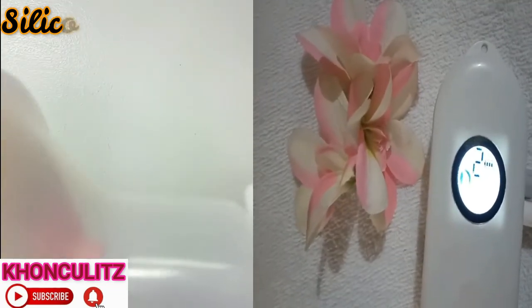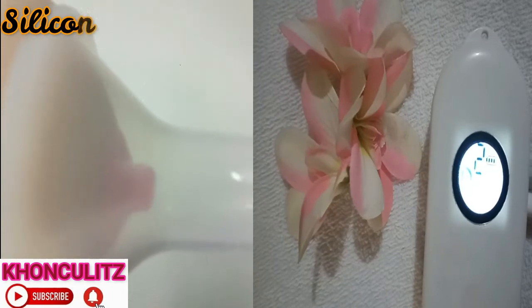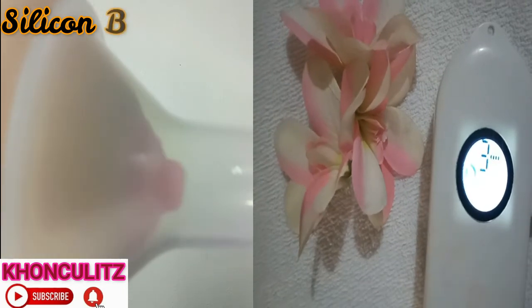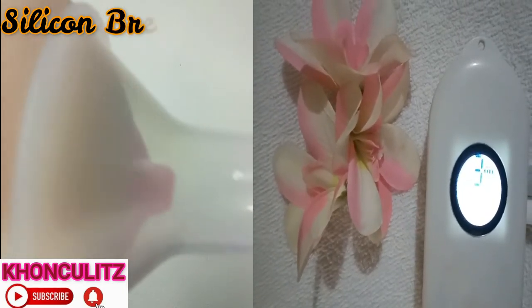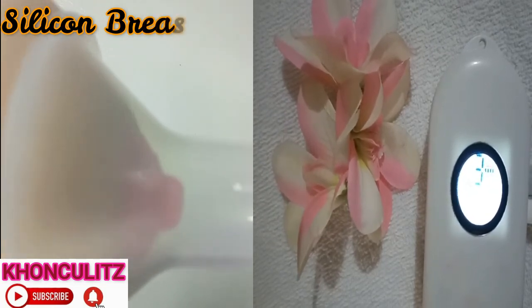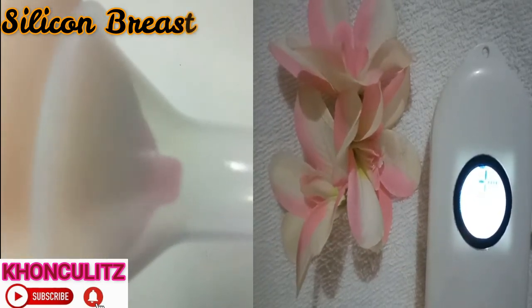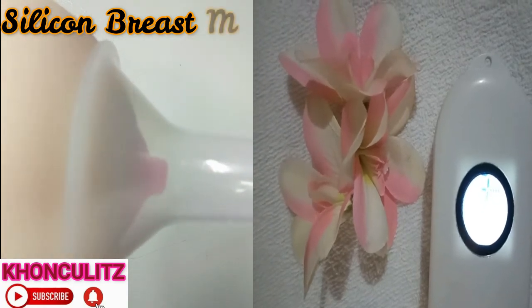Let's have massage mode number three. So you can see the suction, right? This is massage mode number three. Let us have massage mode number four.